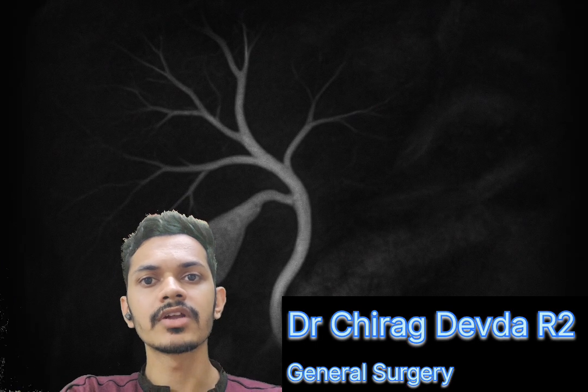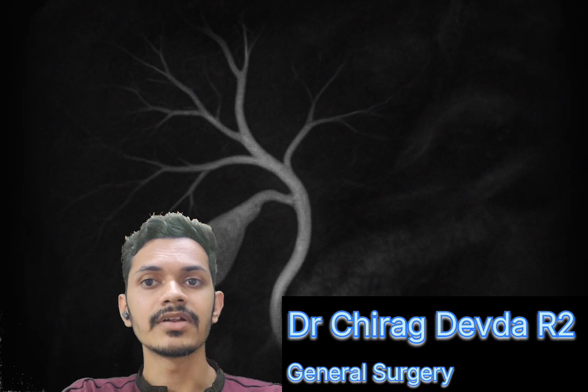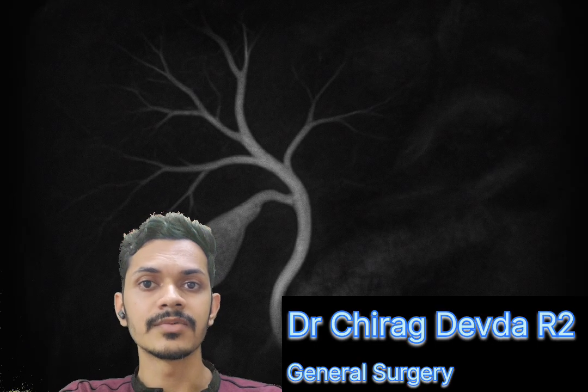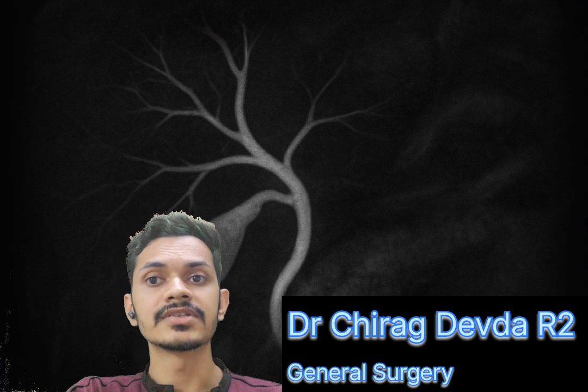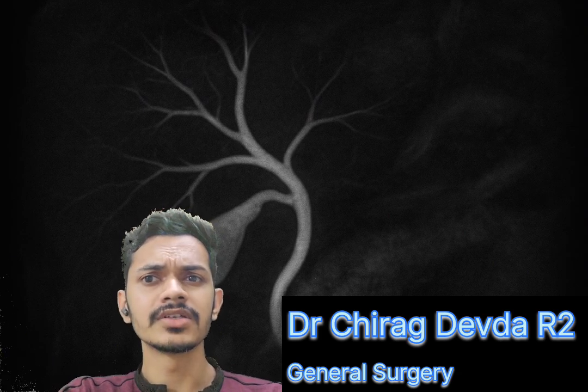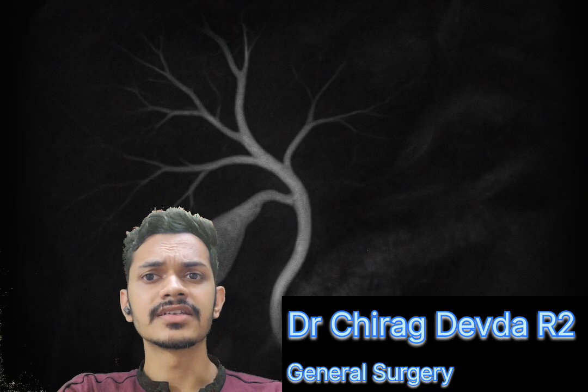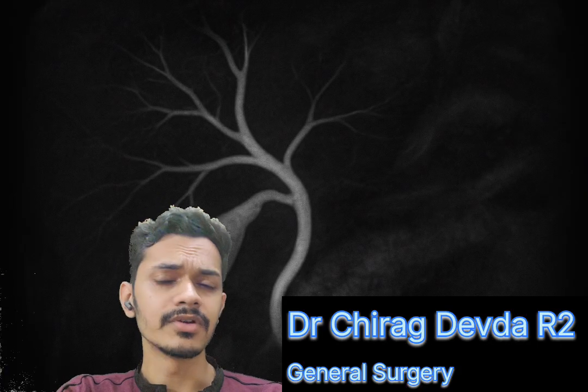If we compare MRCP and ERCP, MRCP is non-invasive while ERCP is invasive. MRCP is not therapeutic, it's diagnostic. ERCP is therapeutic plus diagnostic. There are no major complications in MRCP unless there is MRI risk. In ERCP, there are chances of pancreatitis, bleeding or perforation.